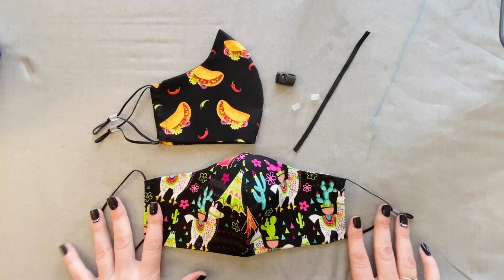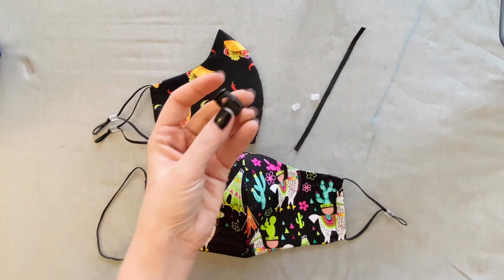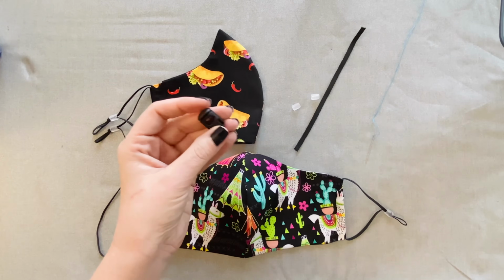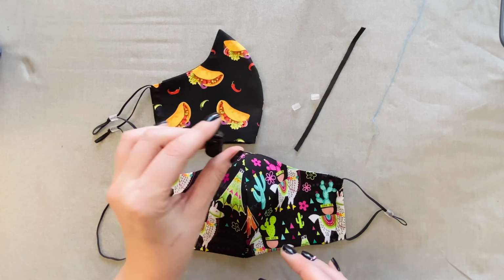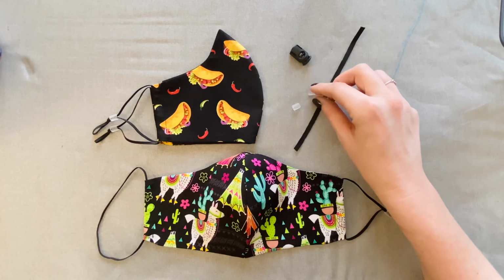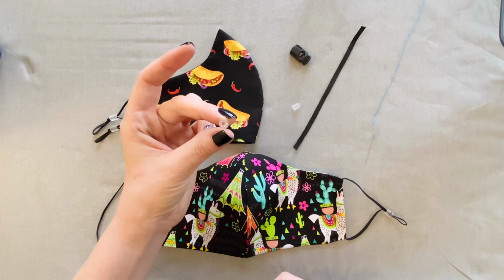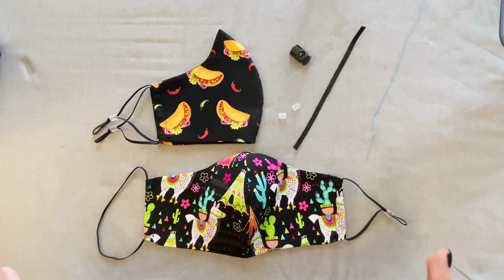And I used to use these guys right here, and they're these thick cord locks, and I quickly found out kids do not like these. They're very heavy behind the ear. They're not comfortable, so I use these for other things now, but I don't use them for masks. But what I did find was these little plastic guys. It's got a big end and a small end. I found them on Etsy, and I'll link them below. And they're surprisingly easy to attach.